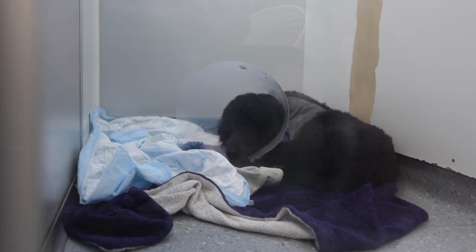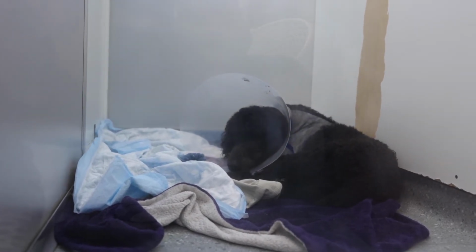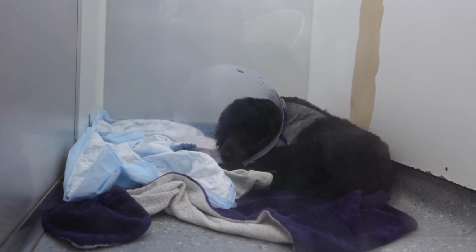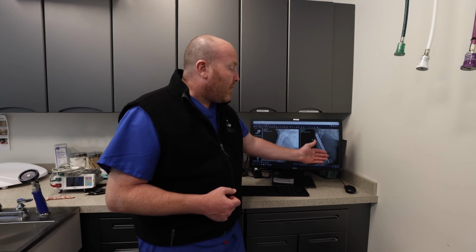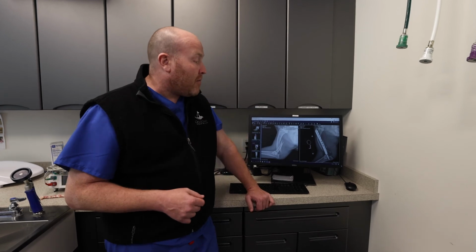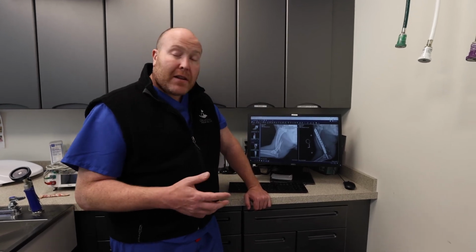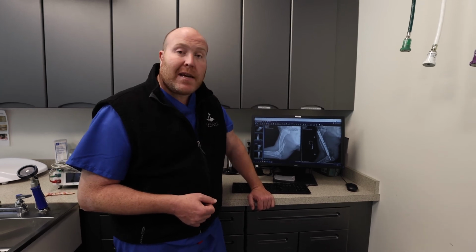Sully's doing very well. He's now 1 day post-operative, and we're very happy with his overall recovery. We hope that he goes on to a very healthy, long life, and we suspect, since he's a puppy, that this is going to heal very nicely, and all the fragments will begin to glue back together and it'll look like a normal bone. He will keep this plate and rod in here indefinitely unless there's a problem that we have to remove it. But other than that, Sully's doing well today, and we're very happy.